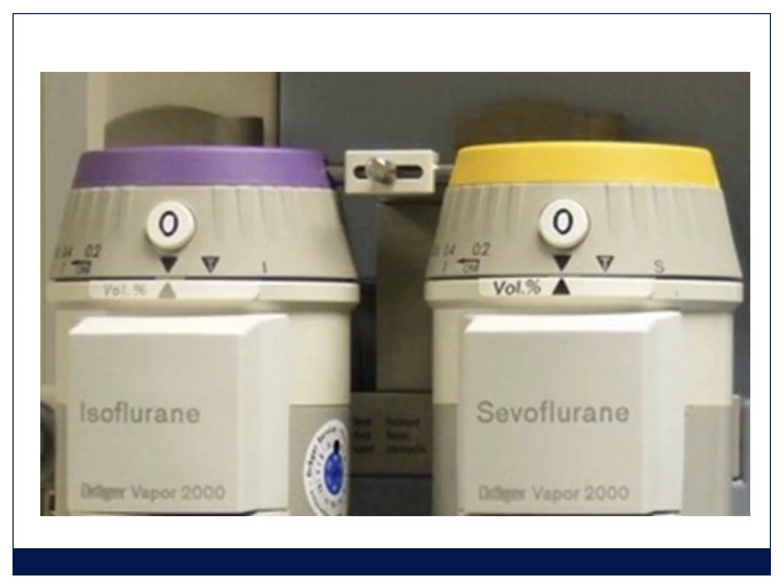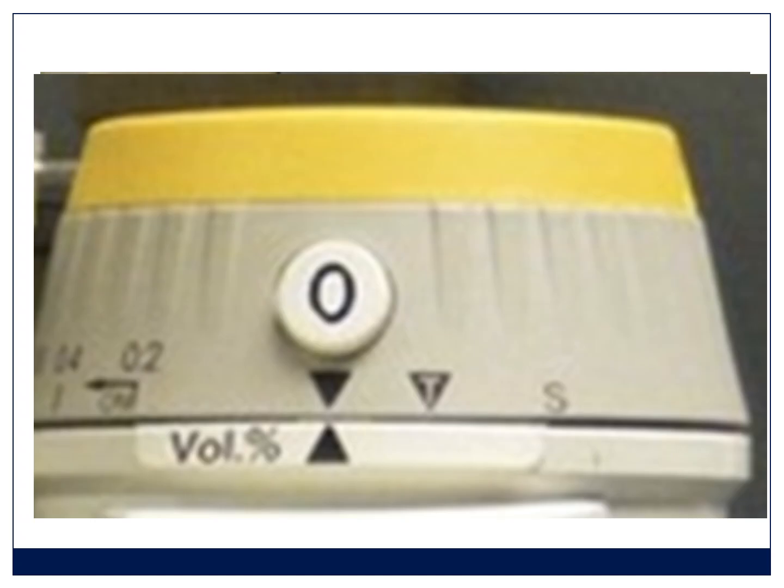You then normally have 2 vaporizers. Make sure that they're filled, at least half full with the correct agent, and they're ready to use. You test something called the interlock mechanism, which means you turn one on and then make sure the other one is not able to be opened. So they actually prevent you administering 2 agents at the same time. And you'll see on the front of these things, the 2 triangles are lining up there. That's the neutral position. And just to the right of the screen, there's a little T there. And if you want to transport it, you have to move the marker to the T, which allows you to travel. And that's basically what that is for. So those should be checked.